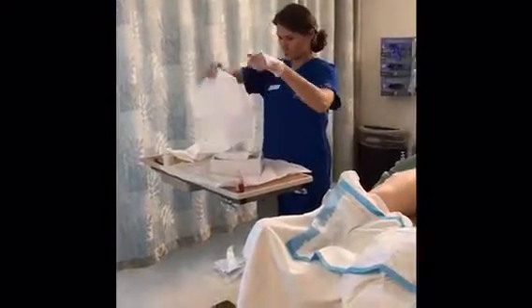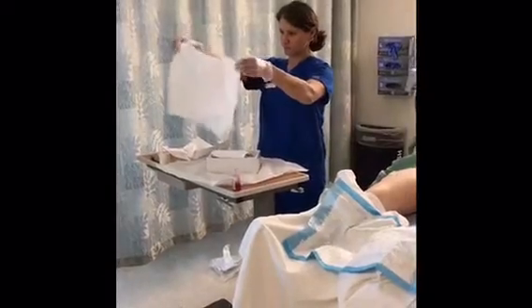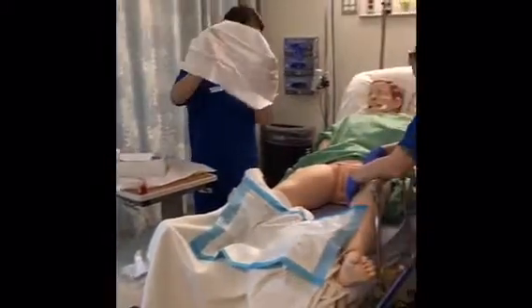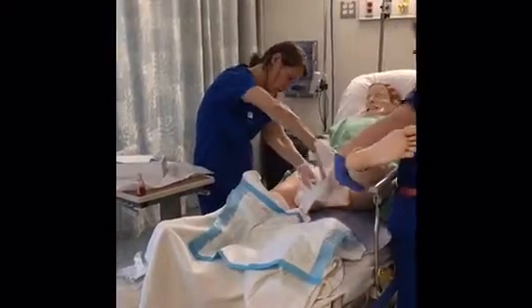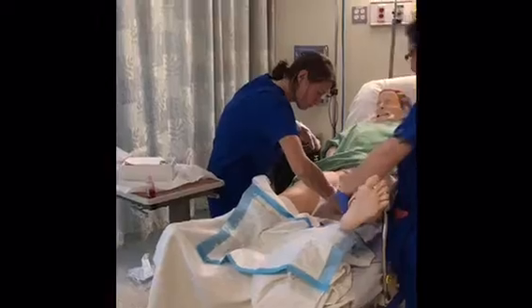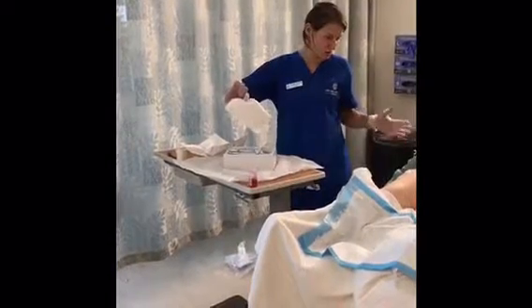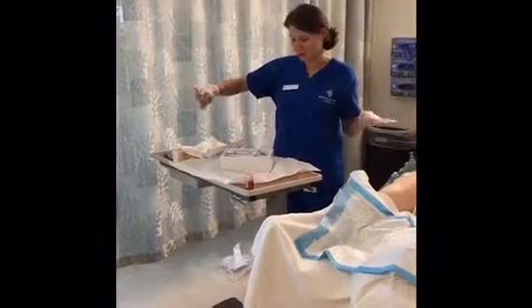I'm going to set up my drape under the patient's buttocks without contaminating the drape, and without contaminating my gloves. And then that's the fenestrated drape, which is used for male. You can use it on a woman, but I prefer not to.